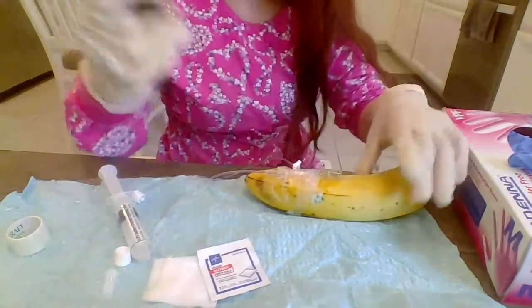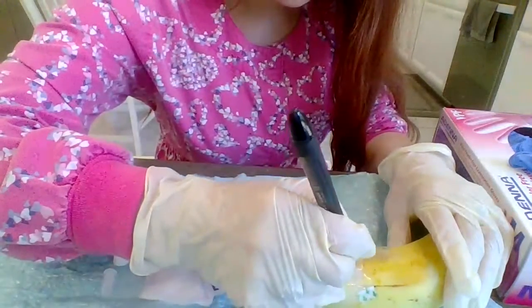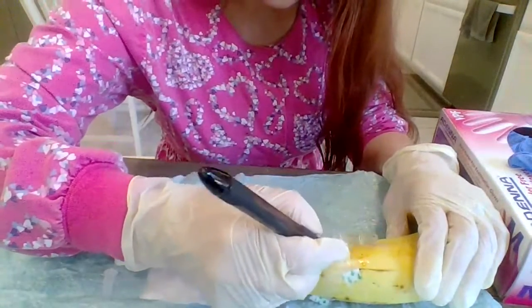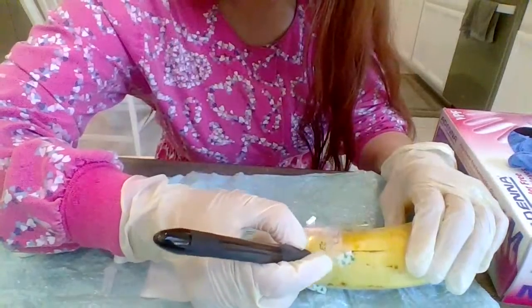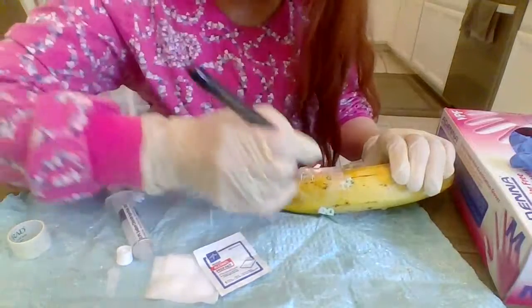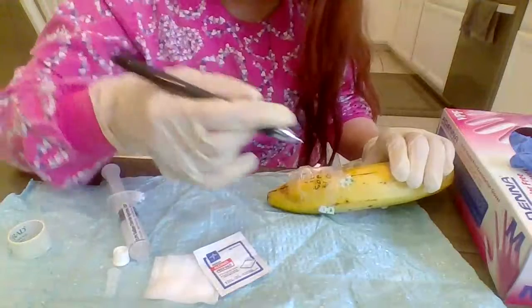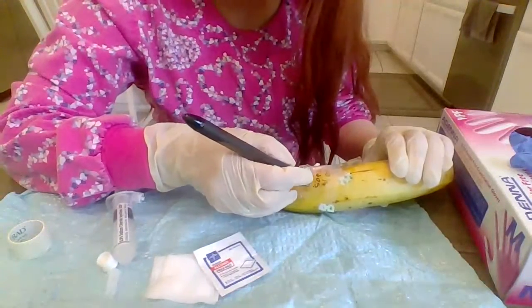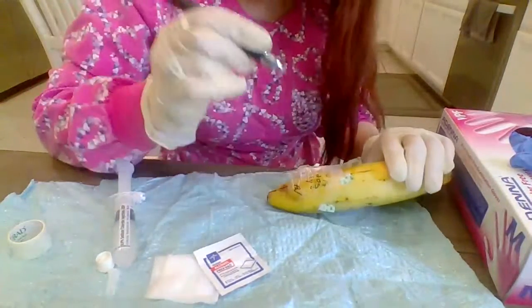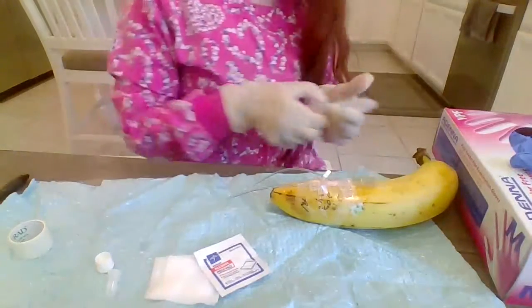And I'm going to go ahead and label it: July 27, 2:30 p.m., a 20 gauge catheter, 1-inch length, and then my initials. So I'm going to go ahead and dispose of all the equipment.